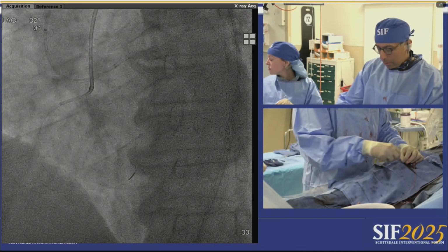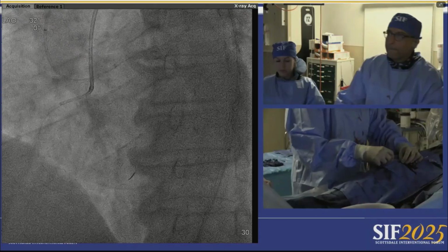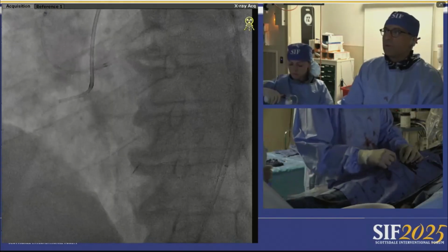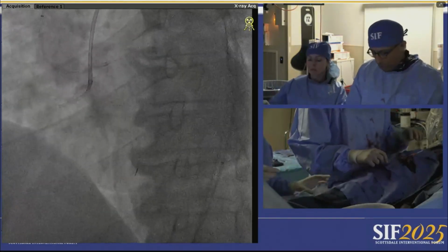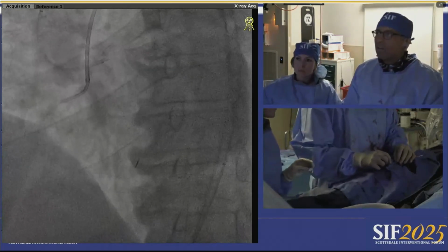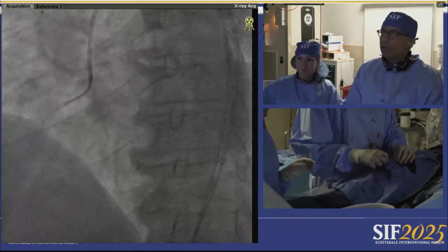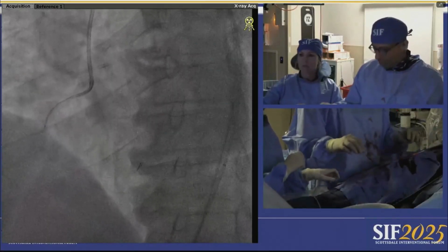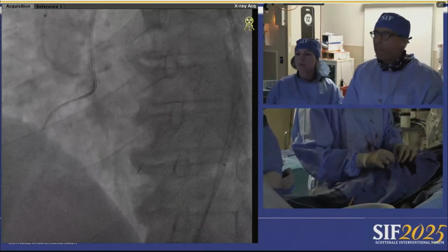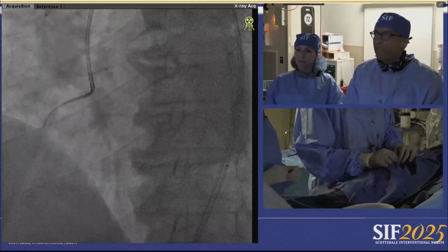We do have data showing that, concentric versus eccentric, there is no differential in stent expansion when we use IVL, so we probably have to consider that. But I want to talk about a slightly controversial point. With these cases, based on the IVUS that I saw, I have been stenting the inflow and using DCB for the outflow.